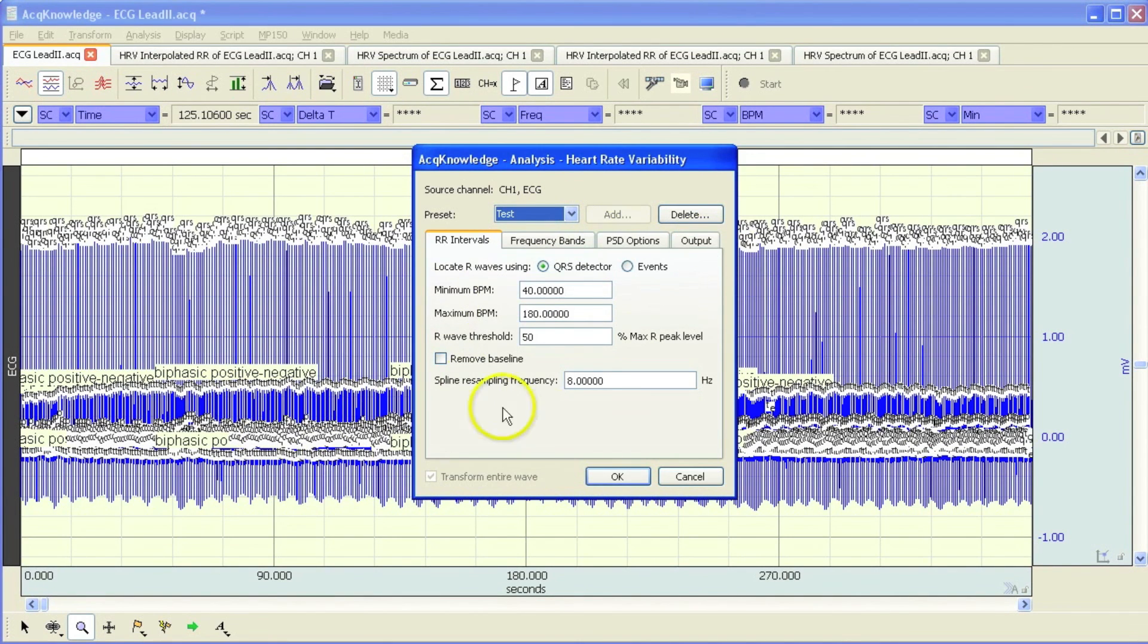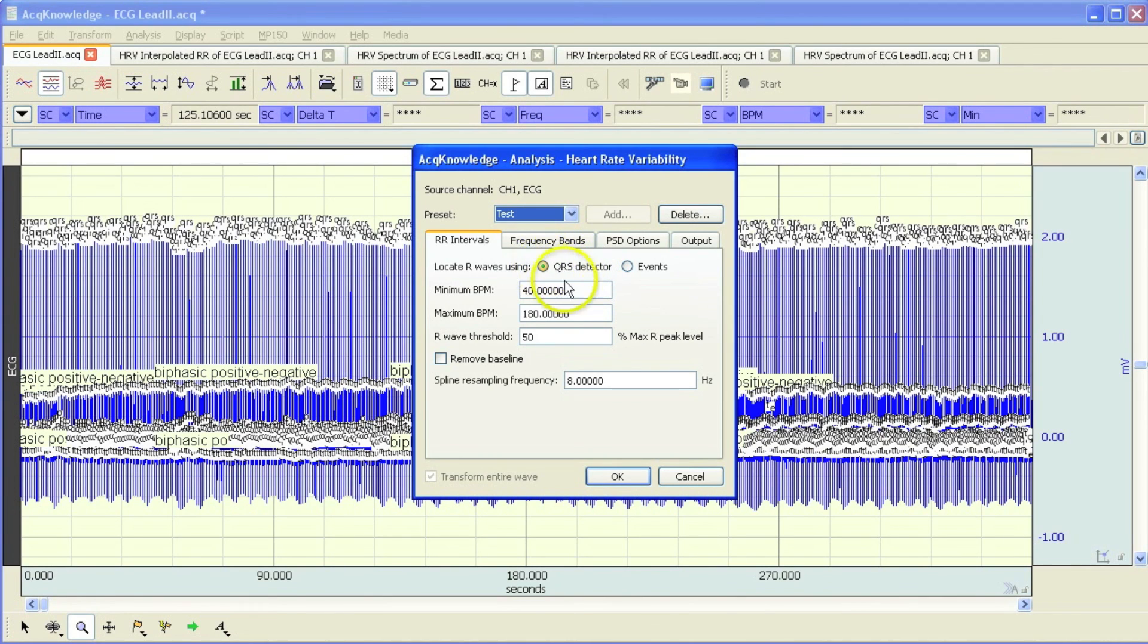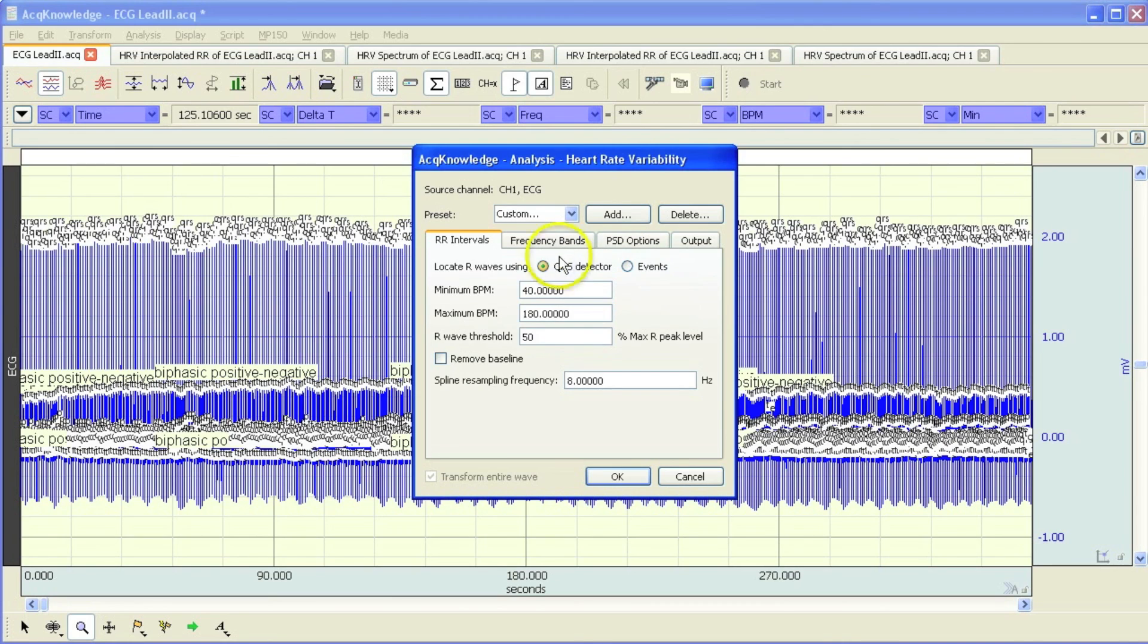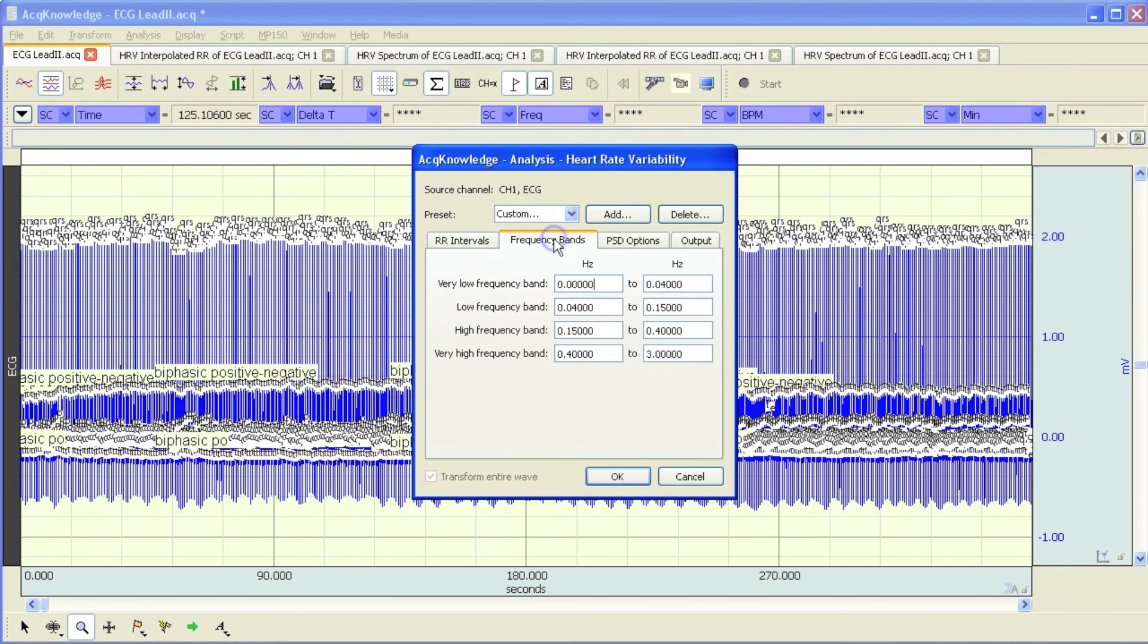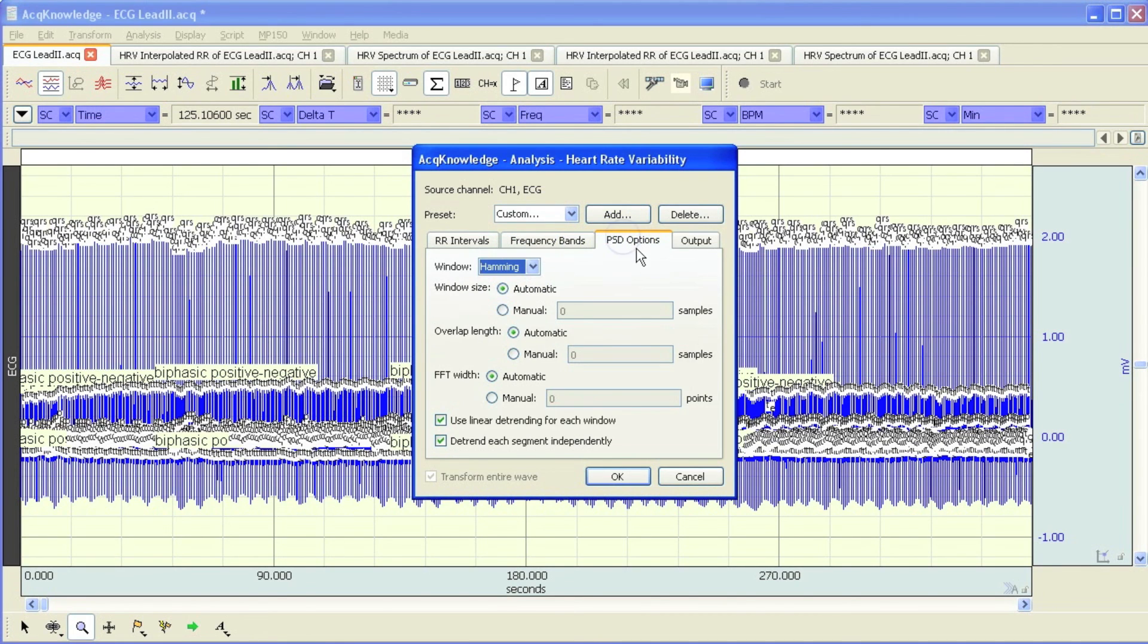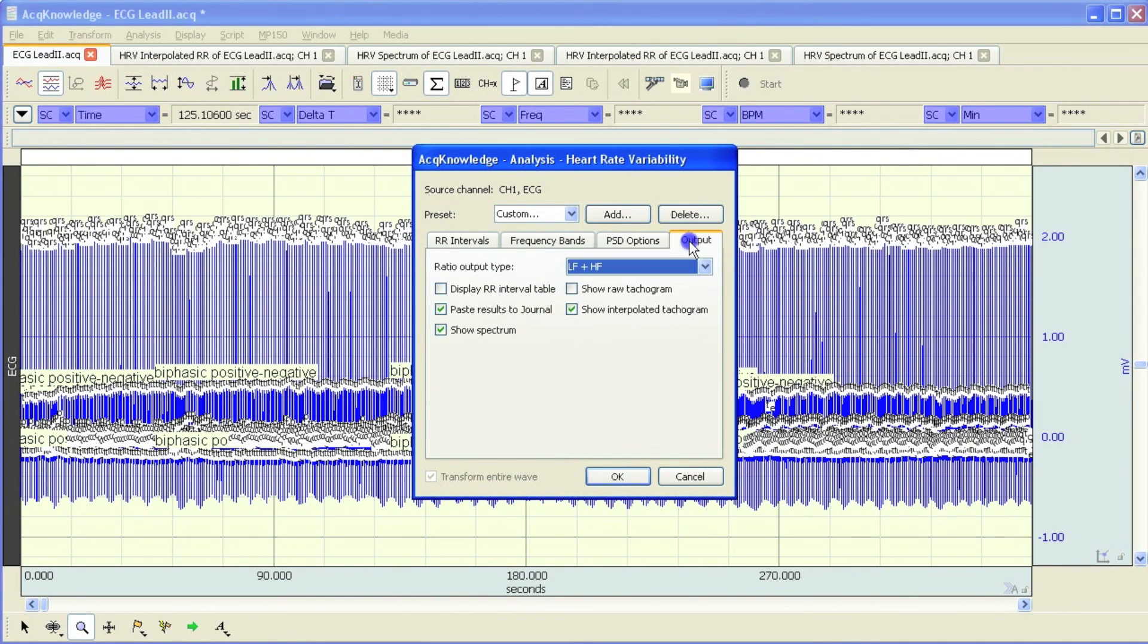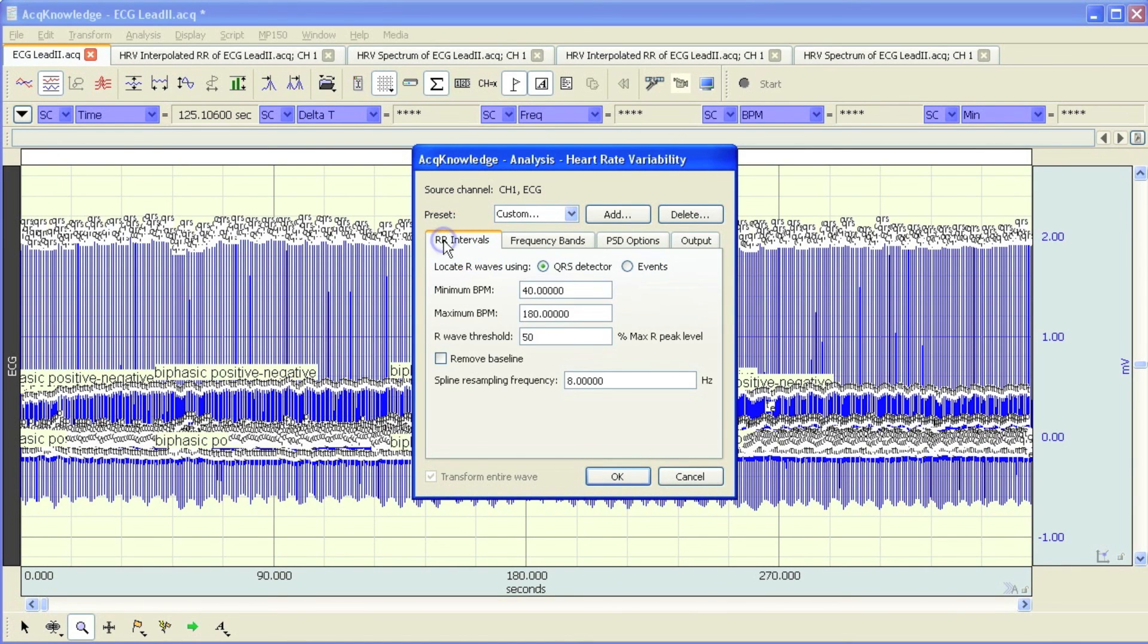So again, this dialog allows us to choose between the QRS detector using events within the data. Set the frequency bands for the very low, low, high and very high frequency ranges. Use automatic or manual PSD settings. And then control the output. So that concludes this demonstration of the Acknowledge Heart Rate Variability Analysis Routine.